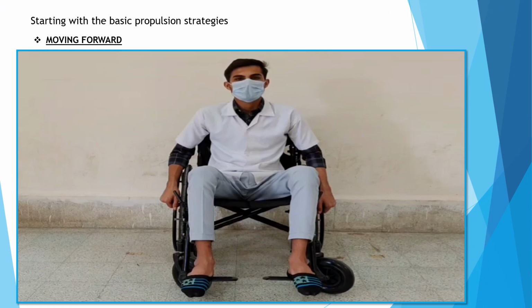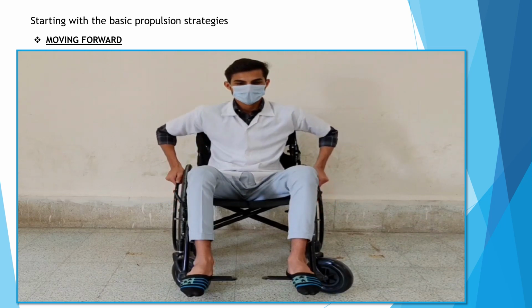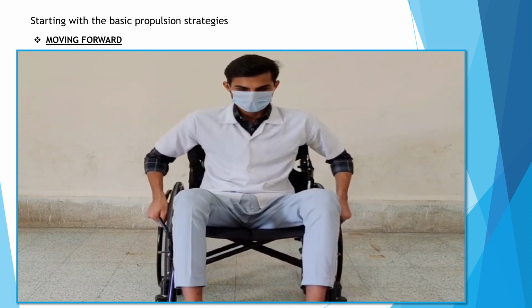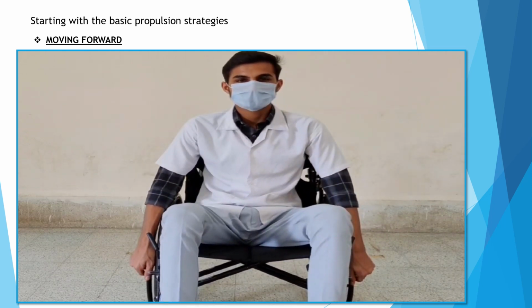Starting with the basic propulsion strategies, the first one is moving forward. Moving forward can be done by propulsion of the bilateral wheels in the forward direction simultaneously.